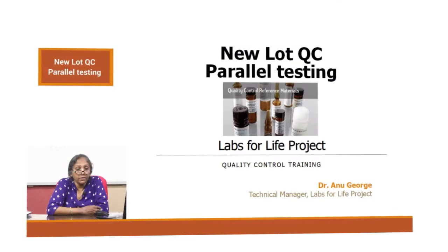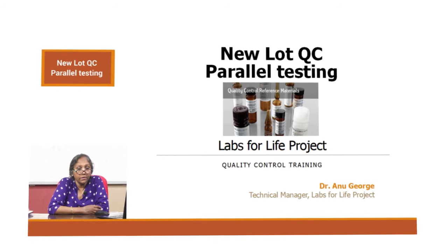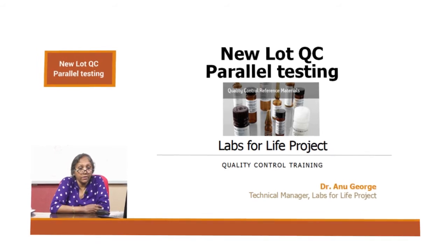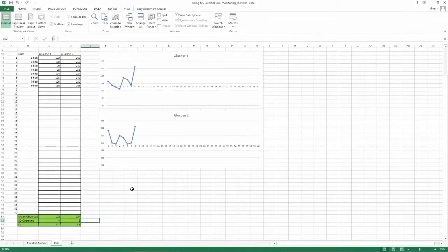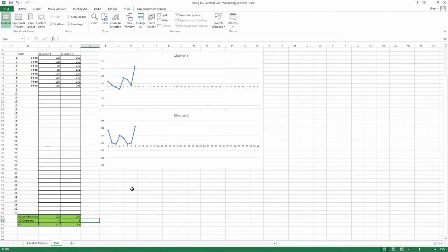Please watch the video on parallel testing to understand the concept better. After doing parallel testing, we have to use the values obtained to plot LJ charts. This process is explained in the second half.